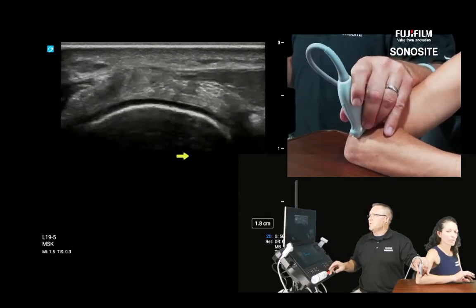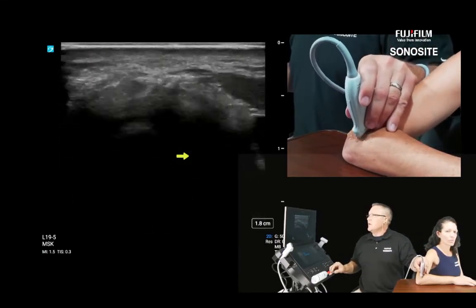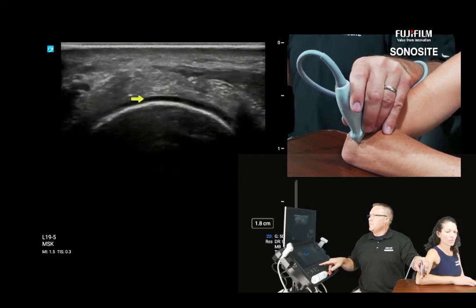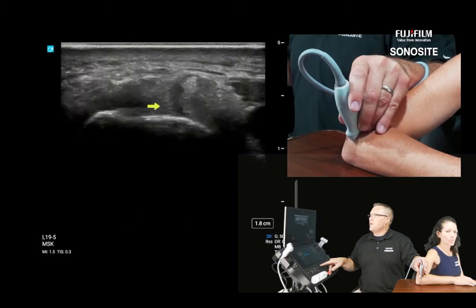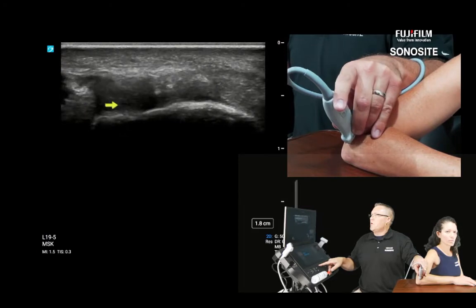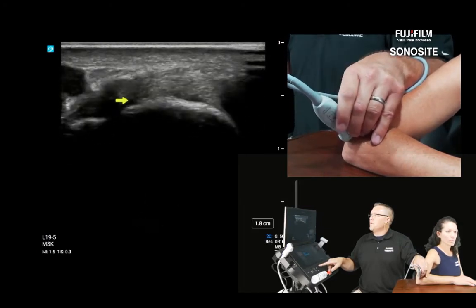So there I've rotated the transducer on 90 degrees here to the radial head. Radial head has the cartilage right here. Lateral epicondyle does not. So I jumped over the joint now. I'm moving proximally, and we're over the lateral epicondyle surface. So this is the more ulnar side of the lateral epicondyle. It has its own little protruding bony facet like we saw on the shoulder.